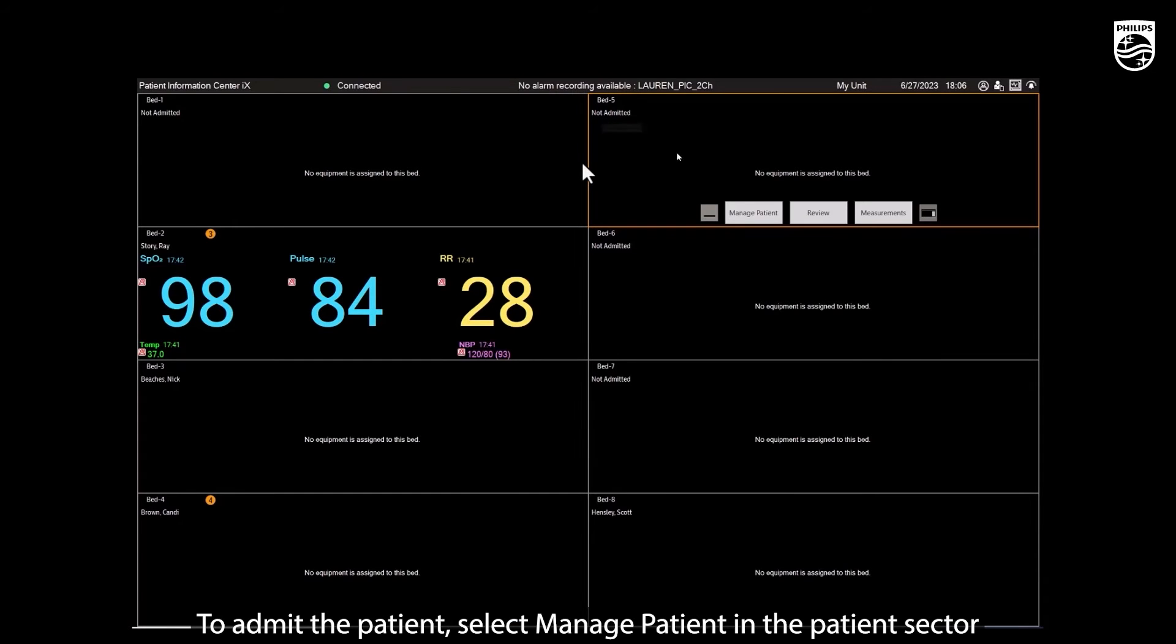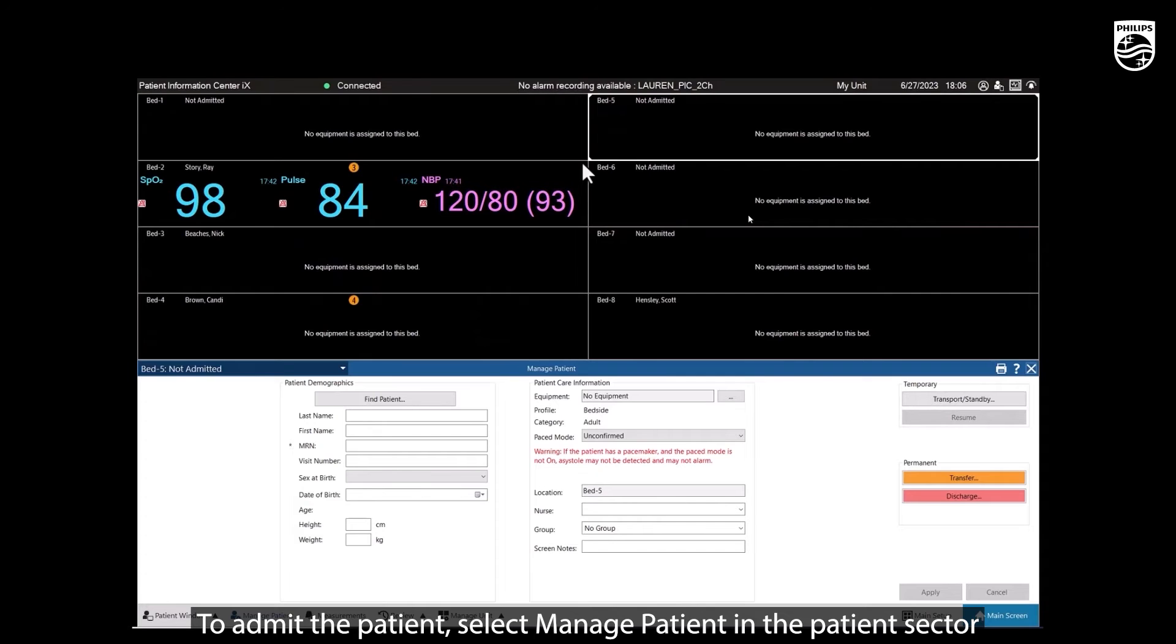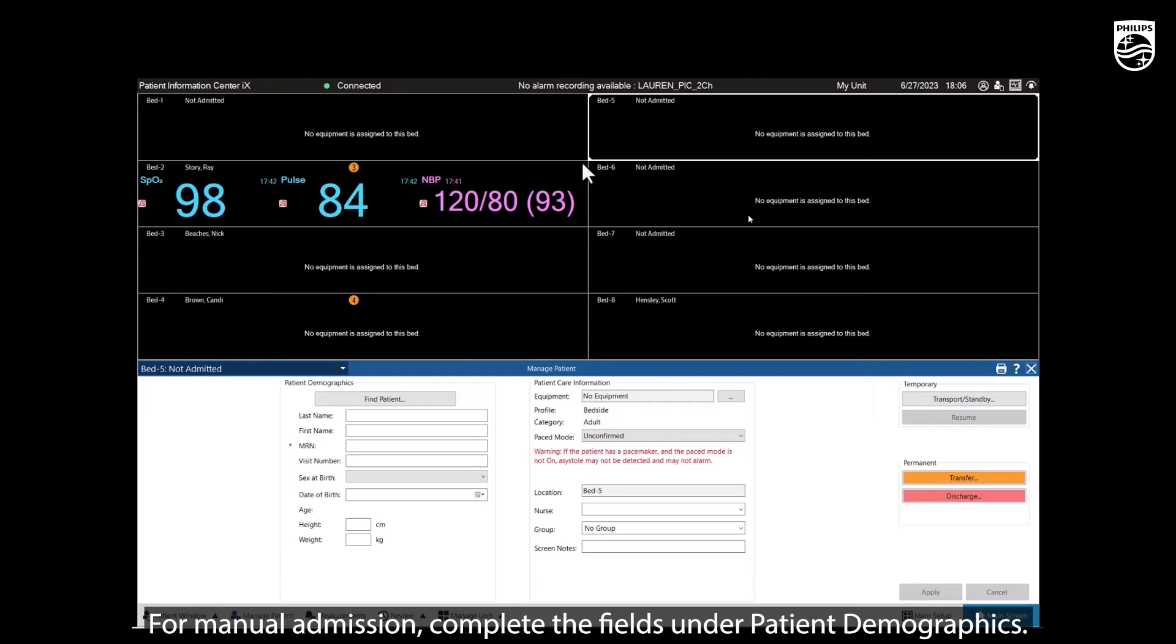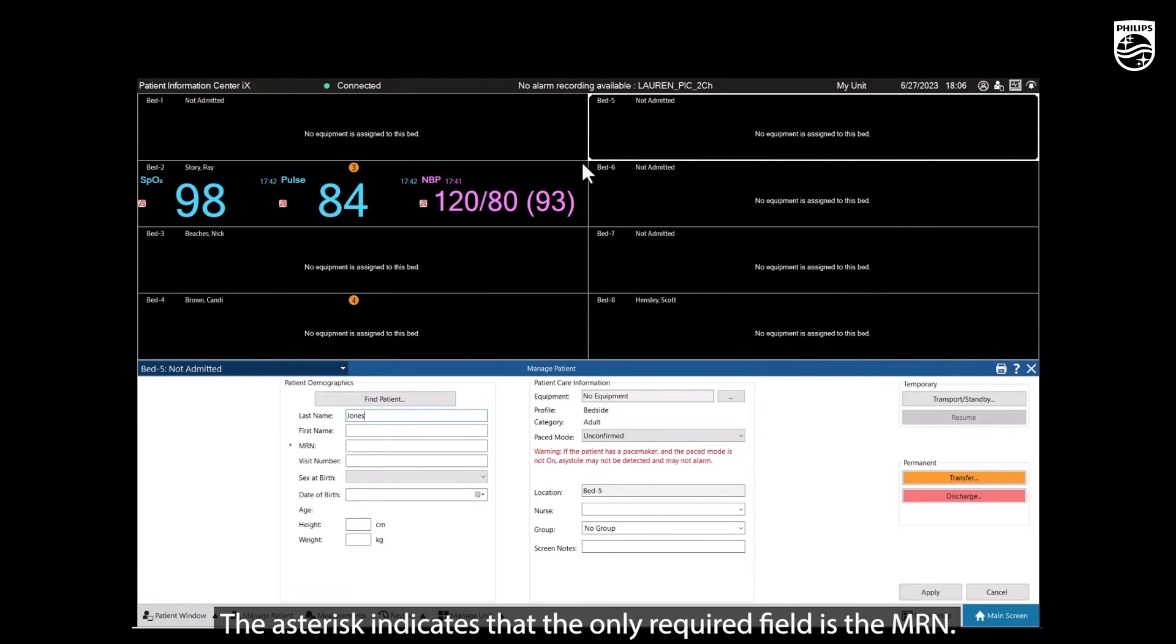To admit the patient, select Manage Patient in the patient sector on the overview screen. For manual admission, complete the fields under patient demographics. The asterisk indicates that the only required field is the MRN.